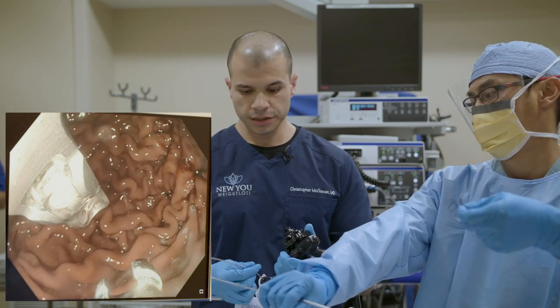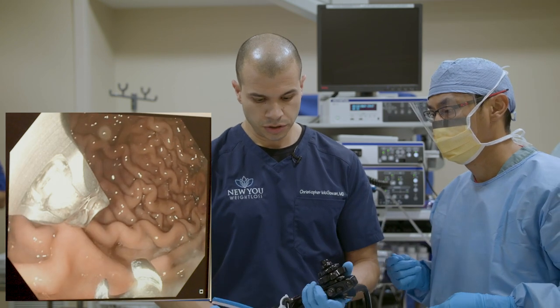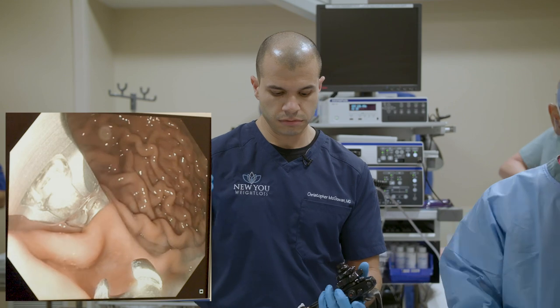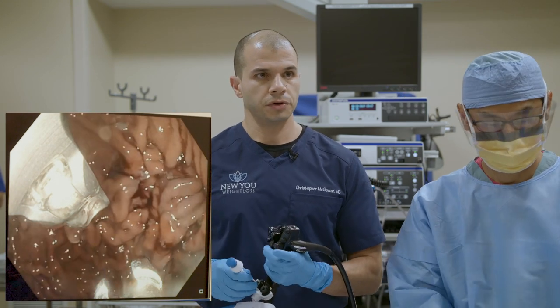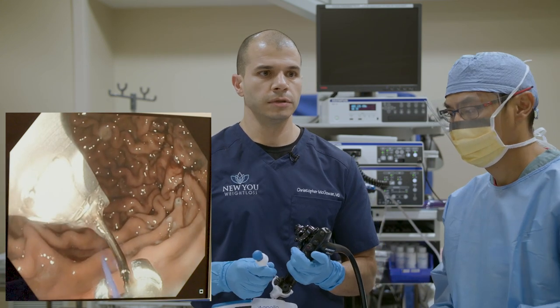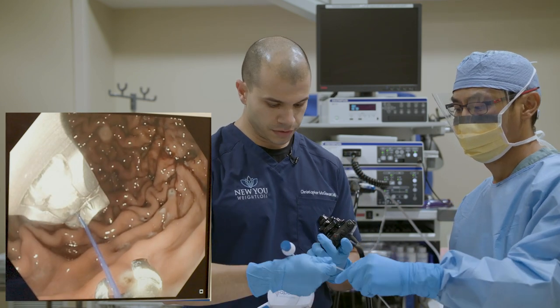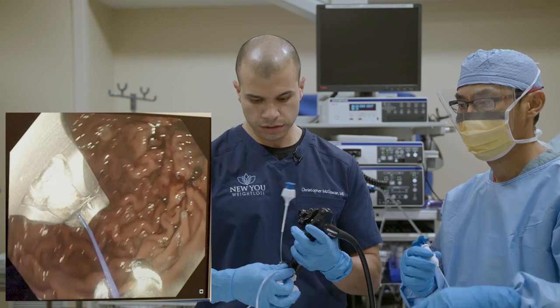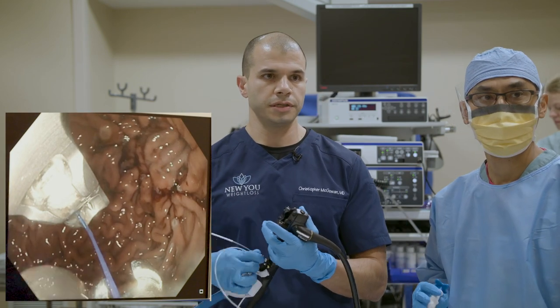We've placed our first suture. What we're going to do now is make another line of sutures, starting here and running kind of hugging what we just did. I'm loading the next suture onto our curved needle body, reloading the helix, and we're going to do the next one. The way we do this is a series of U-shapes, working our way all the way to the top. Suture number one took about eight bites through the stomach wall, which really anchors that suture in there.